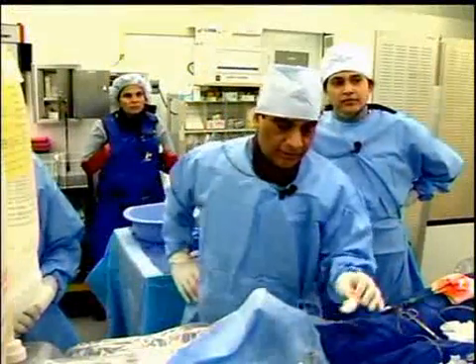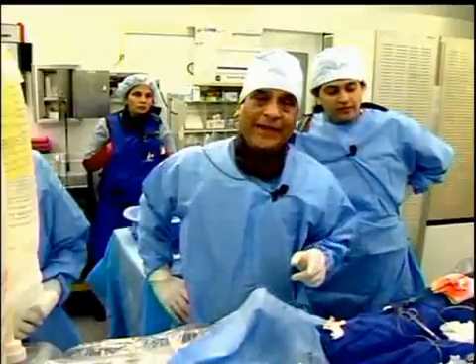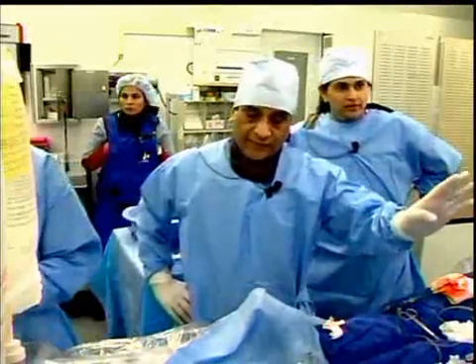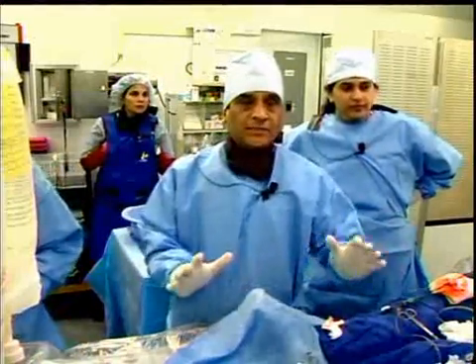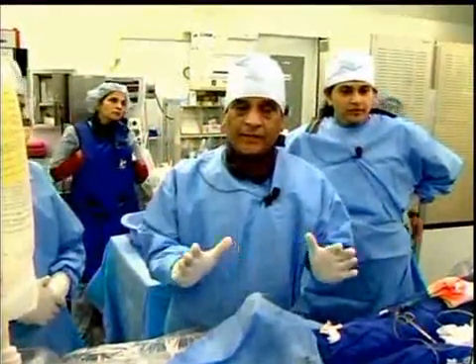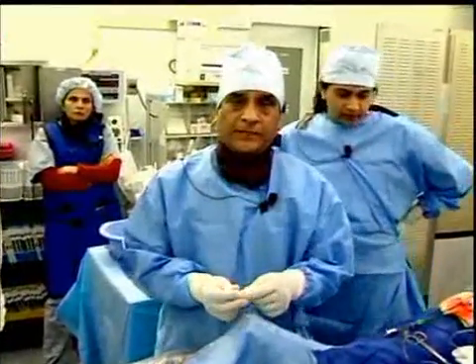We will bring him on Thursday, and that time we'll go through the same issues, but probably what I'll do next time is a rotational atherectomy of the LAD first, because, as one of the viewers asked about the LAD, we'll take care of the LAD and then go after that OM. We know that the OM gets collateral from the right coronary artery, so even if it is just collateralized and remains with less antegrade flow, it's still not the end of the world. Basically, opening the LAD, opening the circumflex, with the right coronary open, in my opinion, should do good for this patient in the long run.